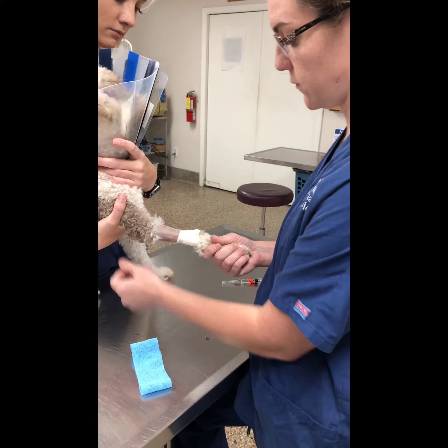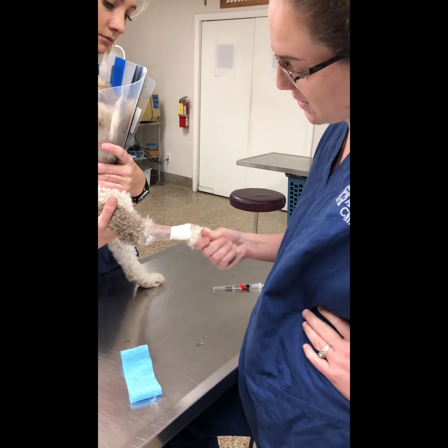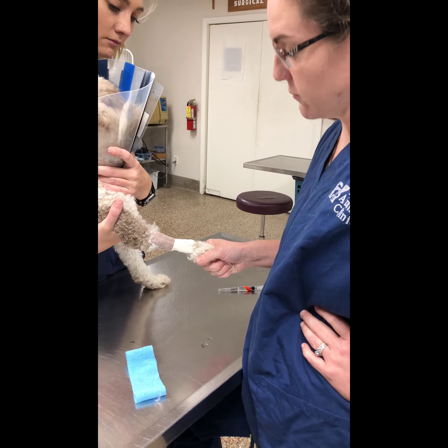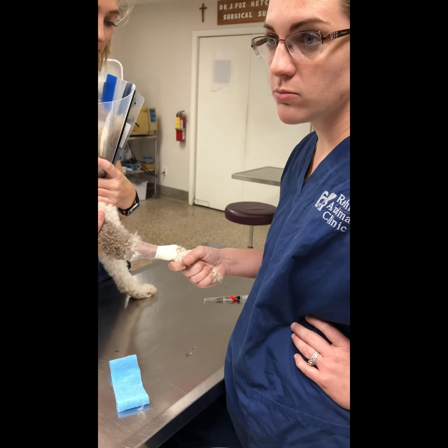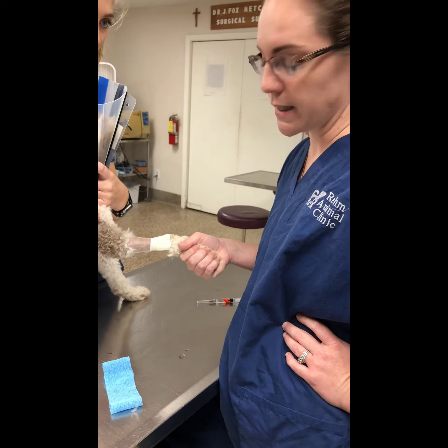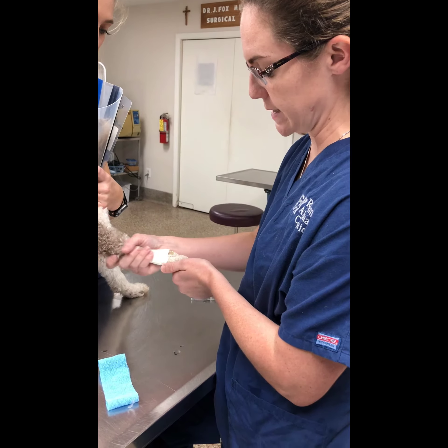I'm also going to be looking for any type of inflammation or phlebitis, or if we have some type of unknown fever, then we want to replace the catheter. This one was just put in this morning, so we don't need to replace it.